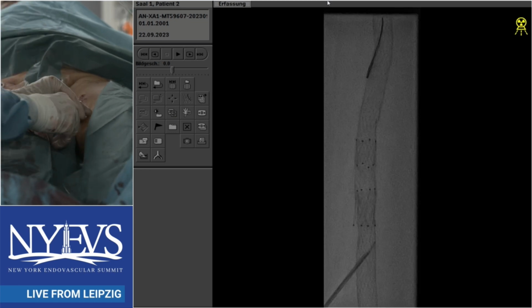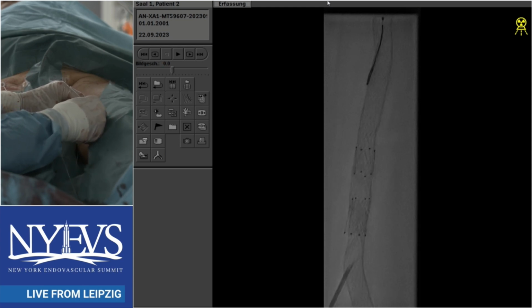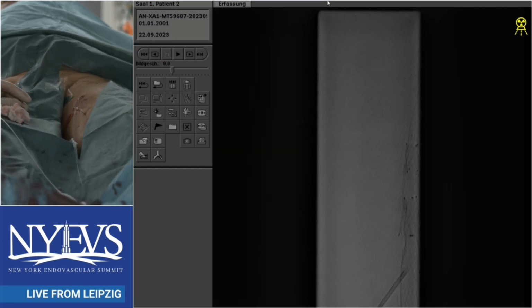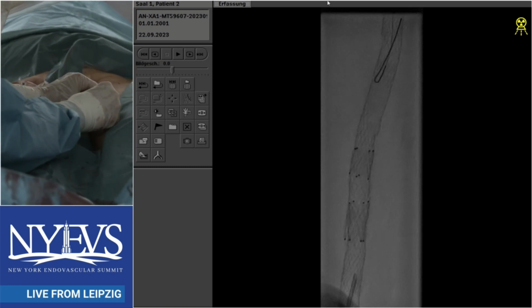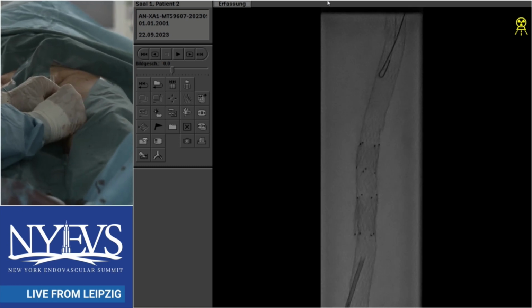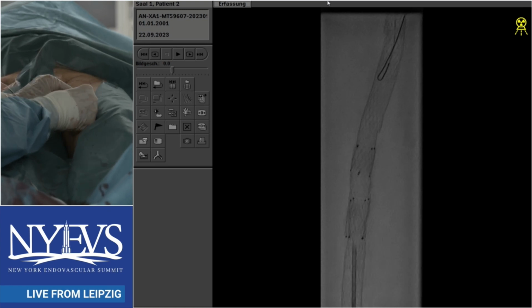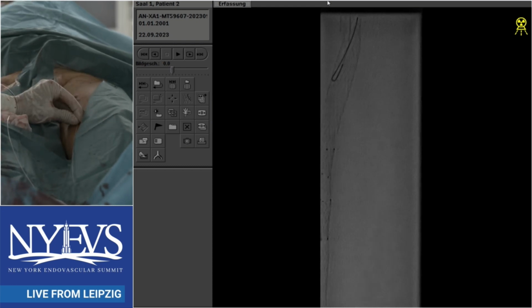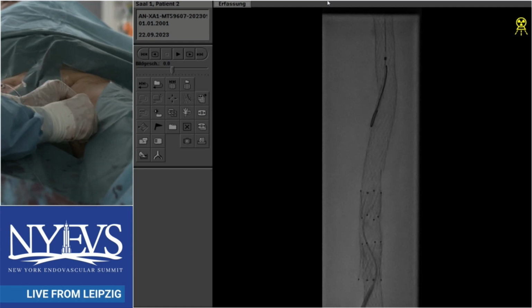You hear the pitch of the device going up when that happens, and it typically blocks automatically. Then the only thing you can do is pull back, maybe do some pre-dilation first, and then have another go, or just leave that segment for what it is and try to cross the device more distally, and then debulk distally. But that is one of the issues that can happen. It also happens with the other devices that they block there. Also with the laser, you have the same issue.